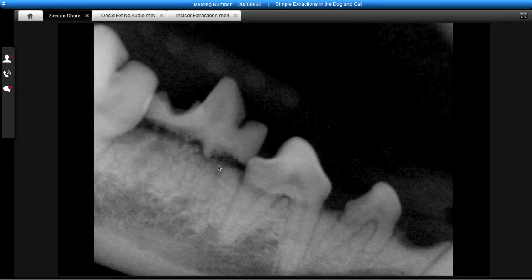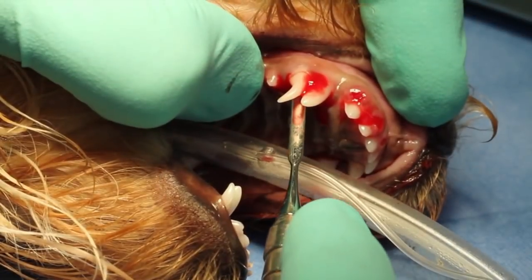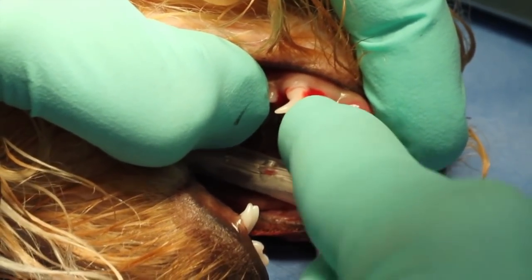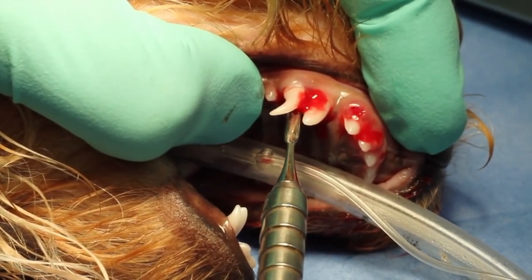There's no root structure because the roots have been resorbed as part of the normal process for deciduous teeth, and we have a crown sitting on top of bone where our only attachment is the gingiva. Now we're going to use a periatome, and the periatome is good for use on the palatal aspect, which we're utilizing here, and also the vestibular aspect because it's flat.